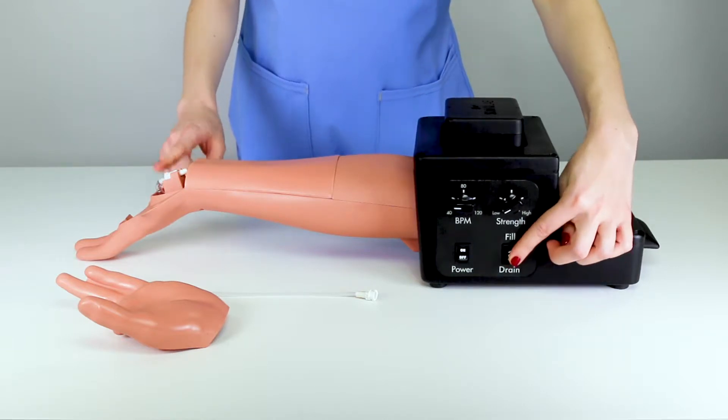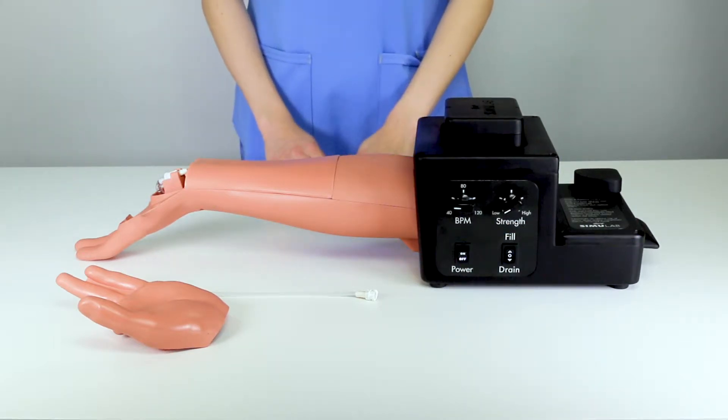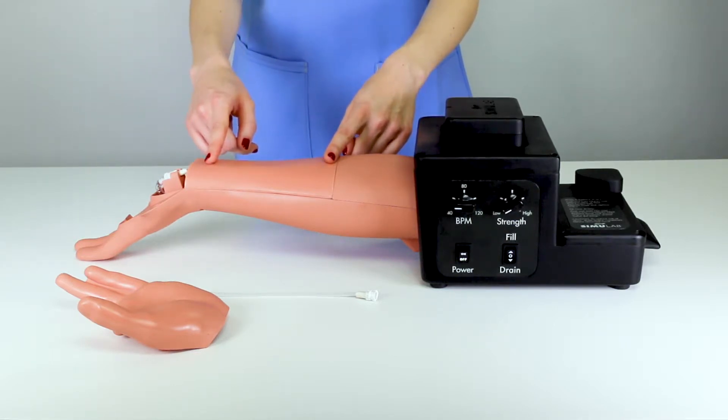Once the system has fully drained, turn the trainer off. It is important to turn the trainer off before removing the tissue to ensure that fluid does not spray from a punctured, pulsing, or draining artery.